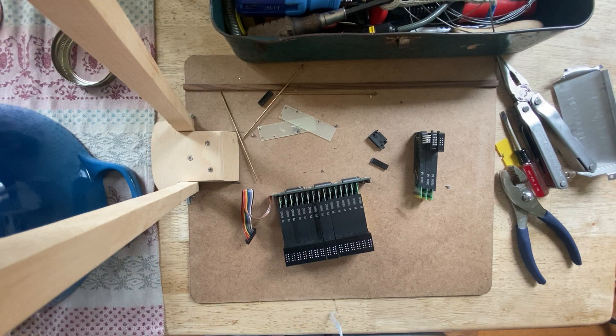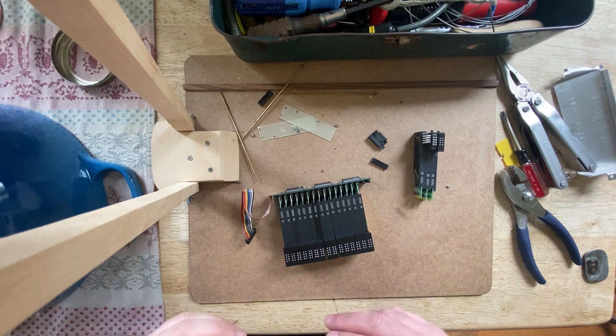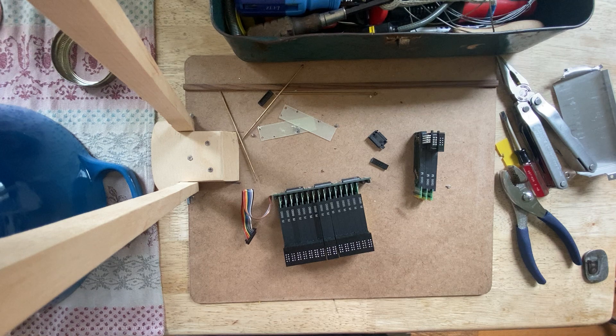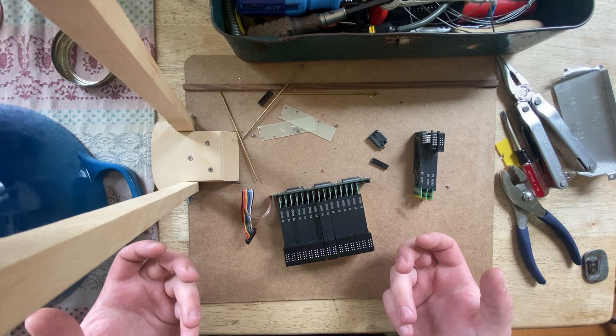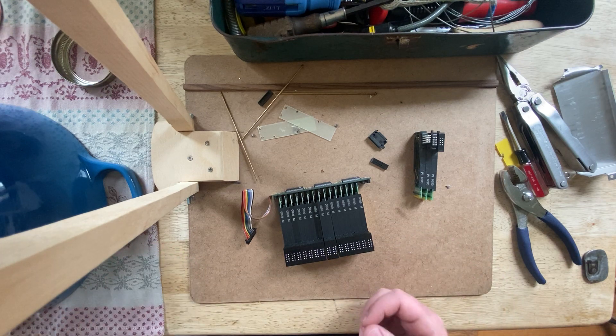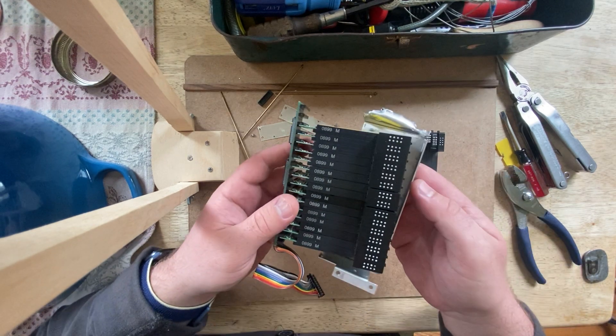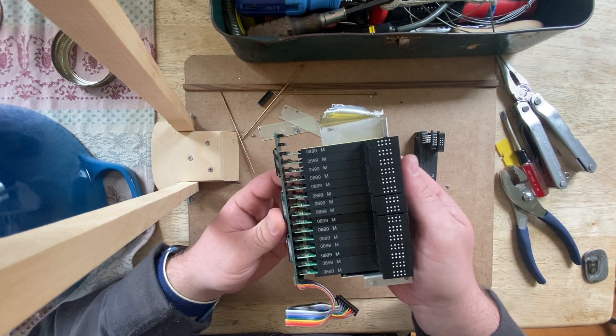Welcome to Charlie's desk. I had a request for more videos about the refreshable braille display, because I took a Braille Lite 2000 apart but didn't continue the series. Now we're going to look at a subsection of that — just taking apart the actual braille display part.